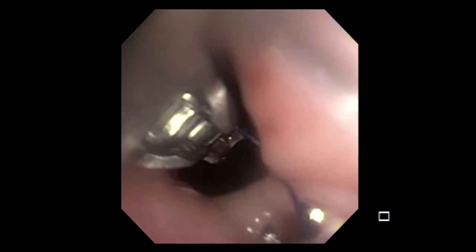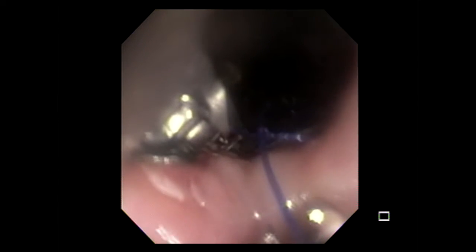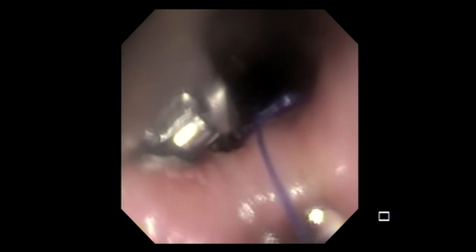Another way of doing that, just to make sure that the stent is secure, we'll go to the other side of the stent and do the same process again. We'll put the needle within the stent in the esophageal mucosa. Once we are deep enough, we'll have our suture go outside the stent, maybe one centimeter above the stent, and do the same thing — making a suture in the mucosa. So we're going from one side, then coming from the other side.